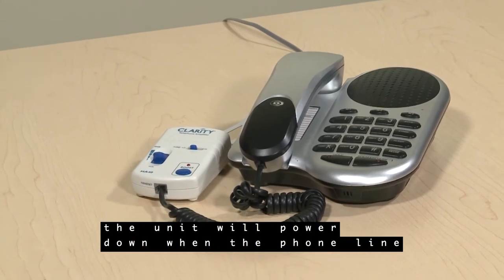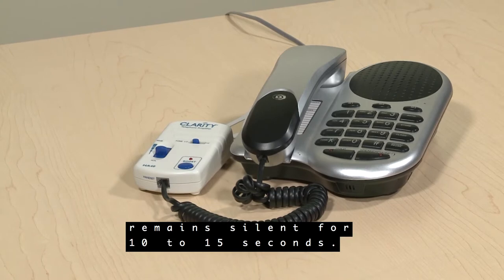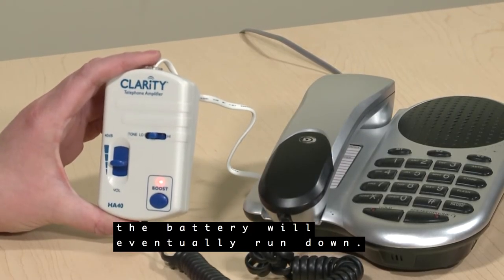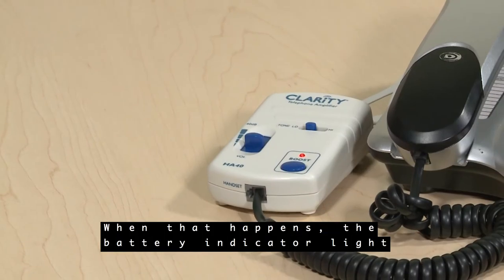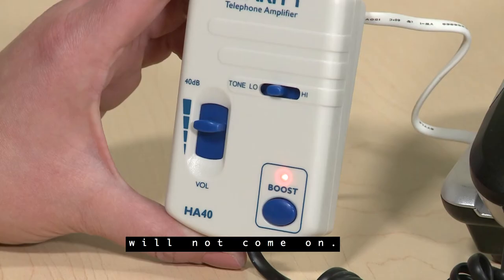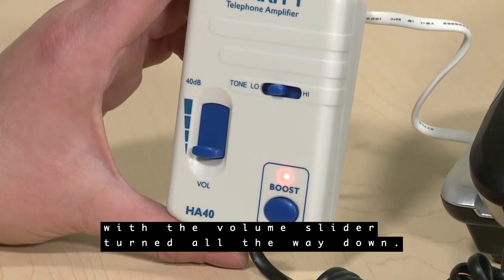In order to conserve battery power, the unit will power down when the phone line remains silent for 10 to 15 seconds. Even with the conservation of power, the battery will eventually run down. When that happens, the battery indicator light will not come on. The phone will still work in this instance with the volume slider turned all the way down.